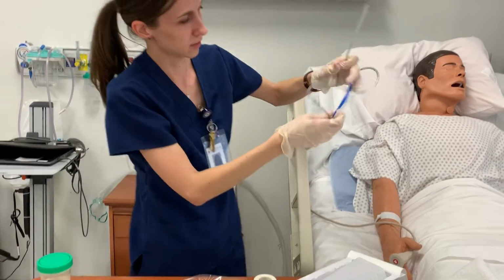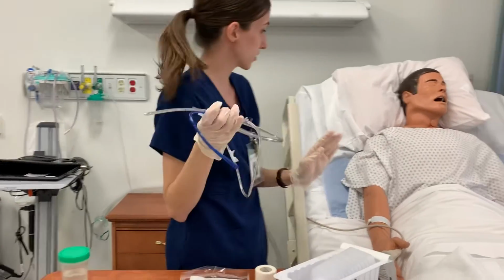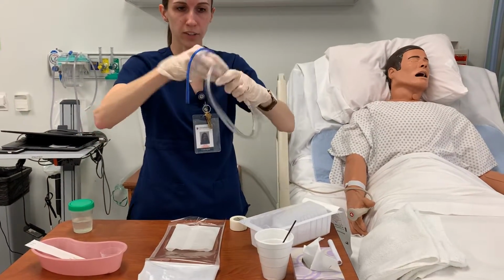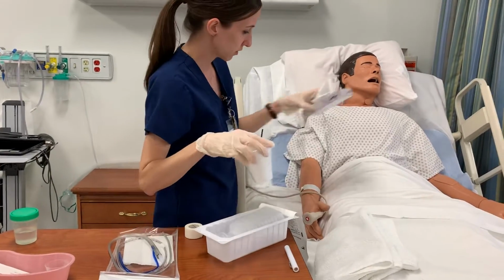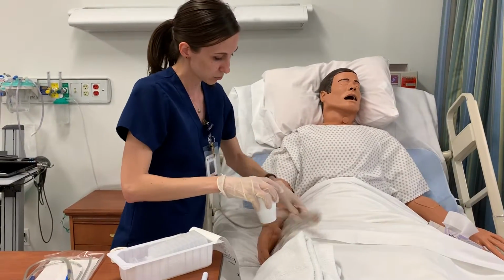All right. And then I know it states that we're going to lubricate the catheter, but first I want to just set up my patient because once I have this lubricated, it's going to be a little bit messy. So I'm just going to place that down in this package. I'm going to make sure that I have the cup and the tissues readily available for my client. I'm going to hand that cup to them.